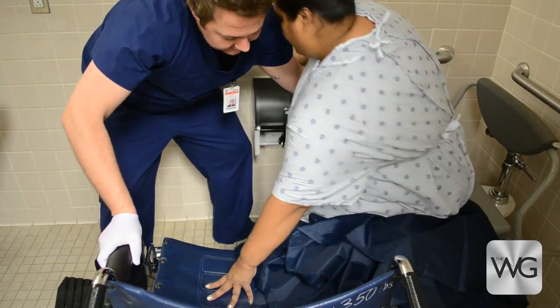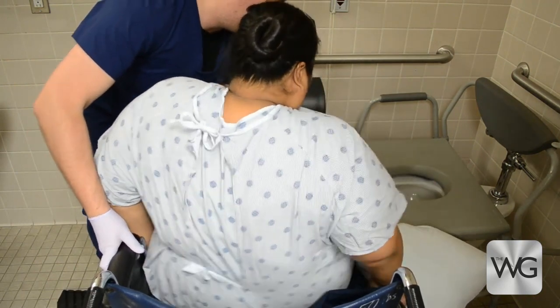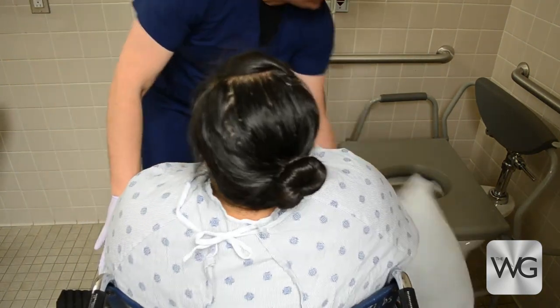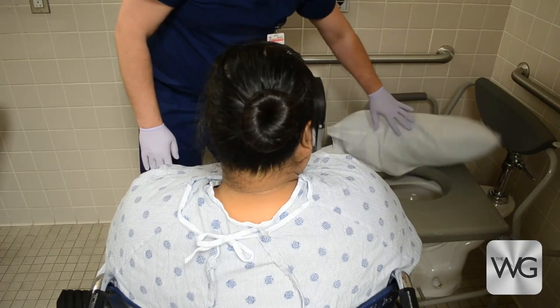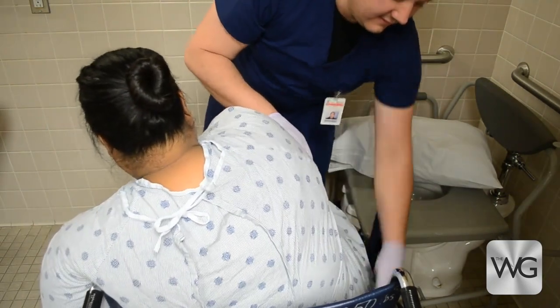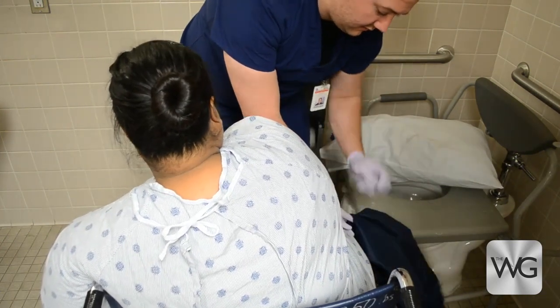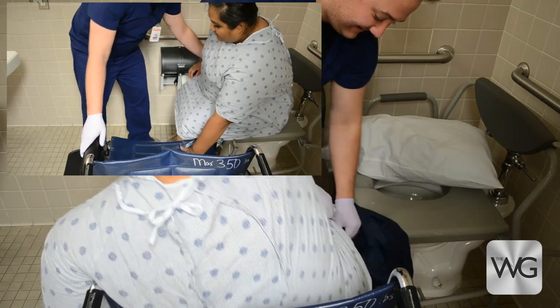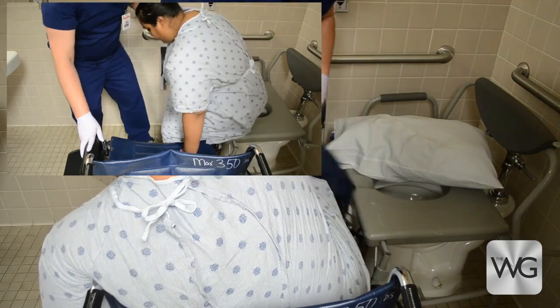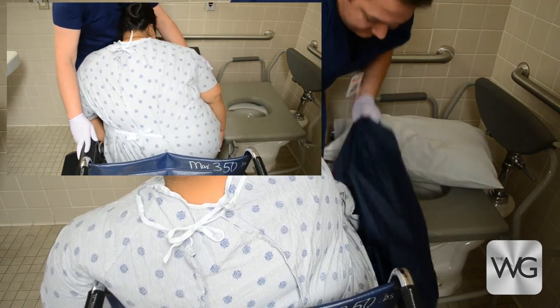The caregiver stands in front of the patient, supports the wheelchair, and prevents the chair from moving or adjusting. The caregiver may need to assist the patient by lightly pushing on the pelvis or hip. Once the patient is in the wheelchair, the slide sheet is removed. Depending on the patient's level of strength, the sit-to-sit transfer may also be performed without the use of a slide sheet. The principle is simple.